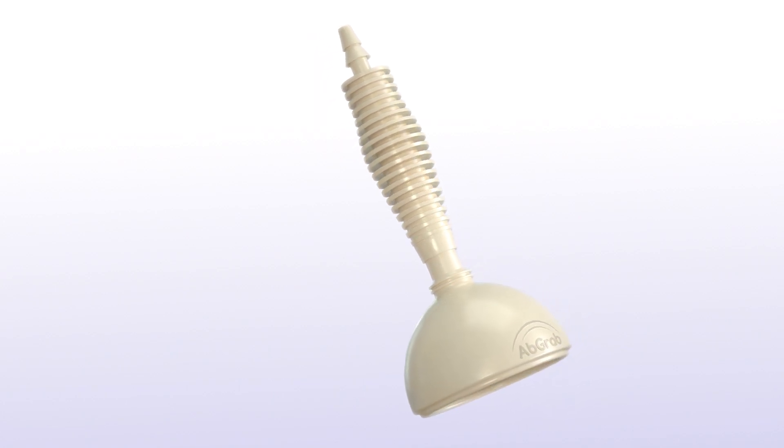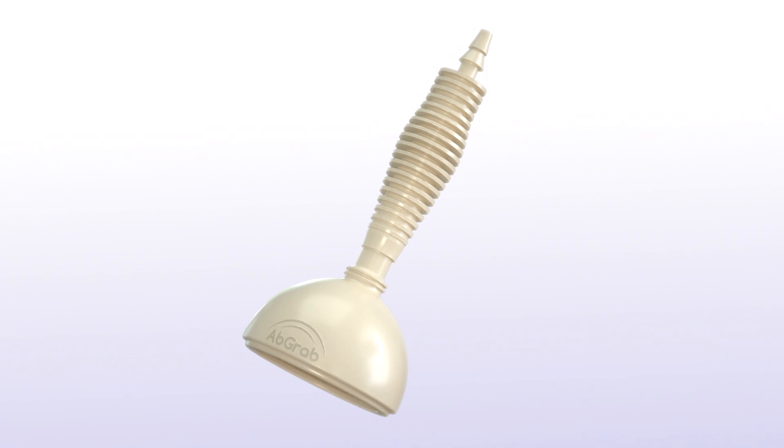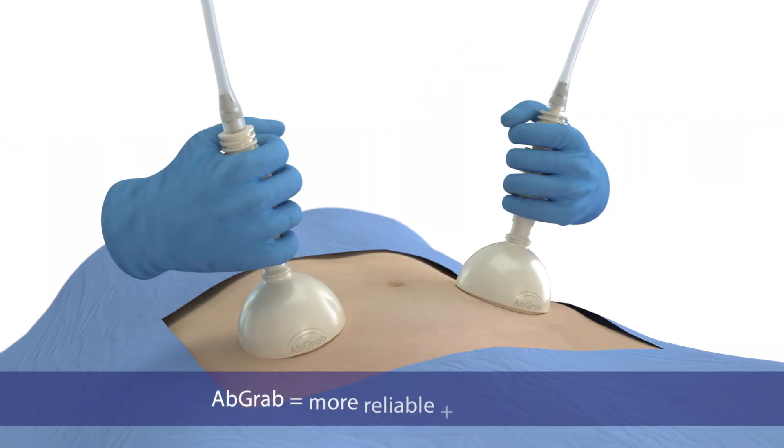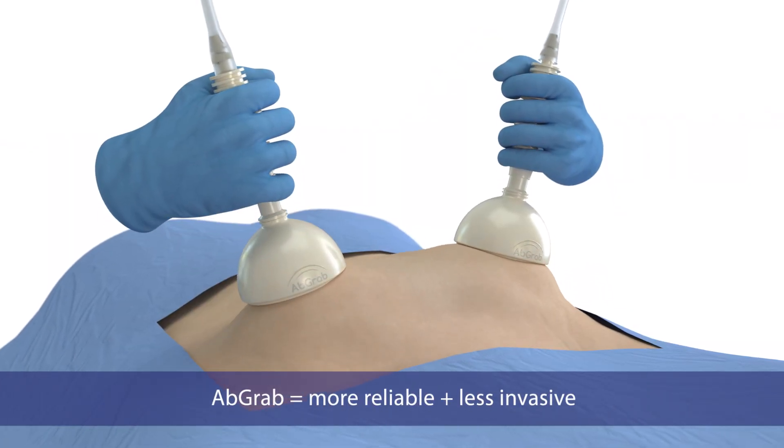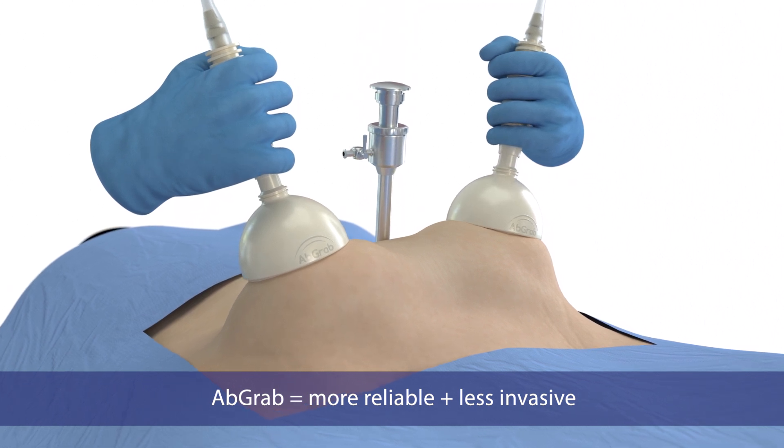Introducing AbGrab, a revolutionary abdominal lifting solution that uses suction to lift the abdominal wall. AbGrab lifts more reliably than manual grasp and is a non-invasive alternative to perforating towel clips.